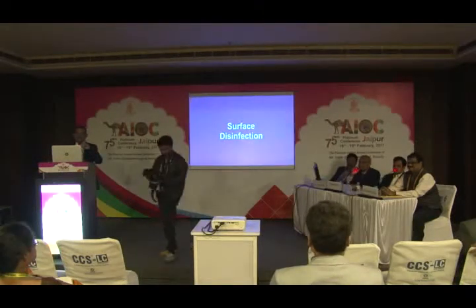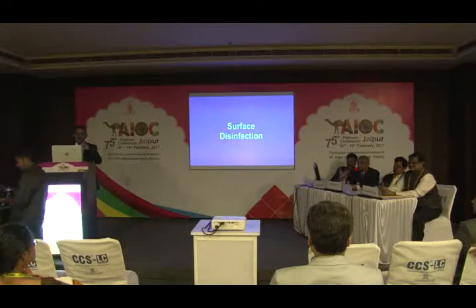Phaco tubes have to be sterilized, autoclaved. Dr. Chitra, you wanted to ask something.